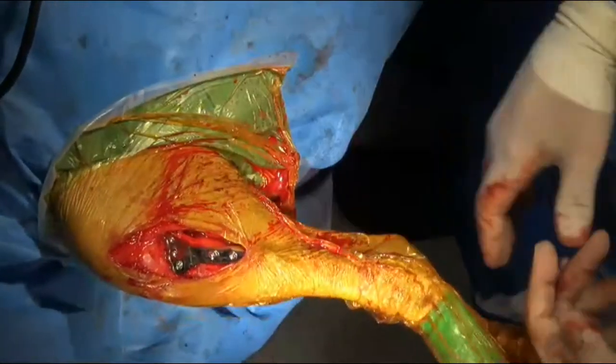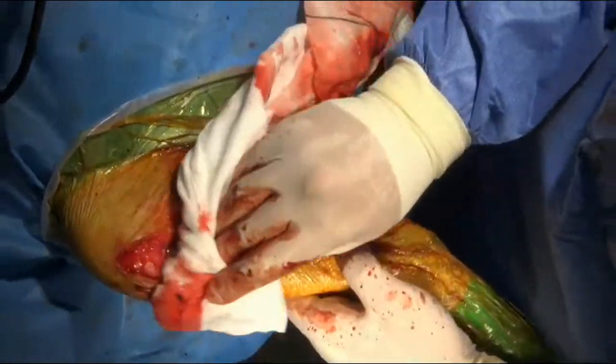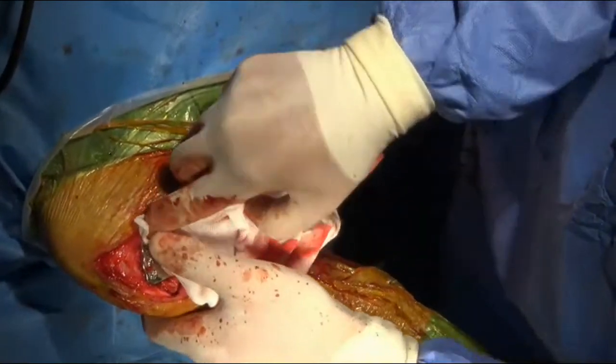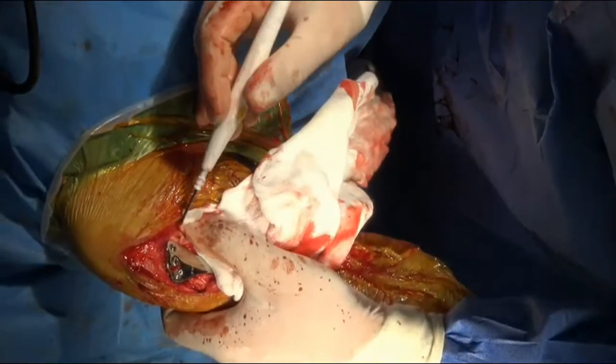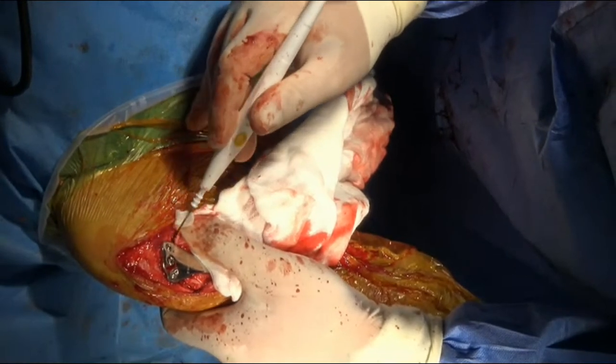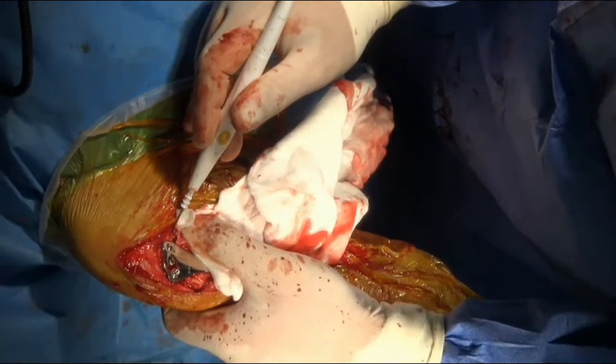Okay, guys, so that was it. CBLO, a bit different to a TPLO. Got an extra screw in there with the headless compression screw. Make sure that all looks okay at the back.